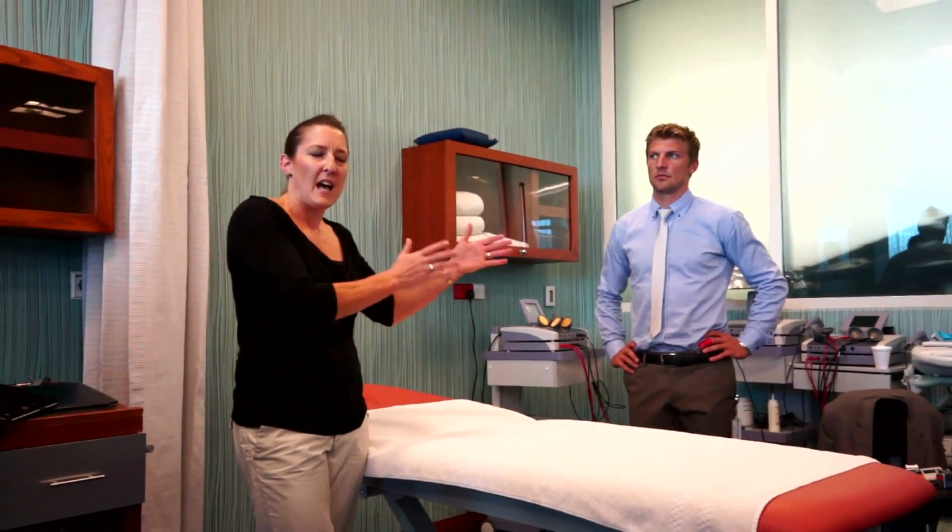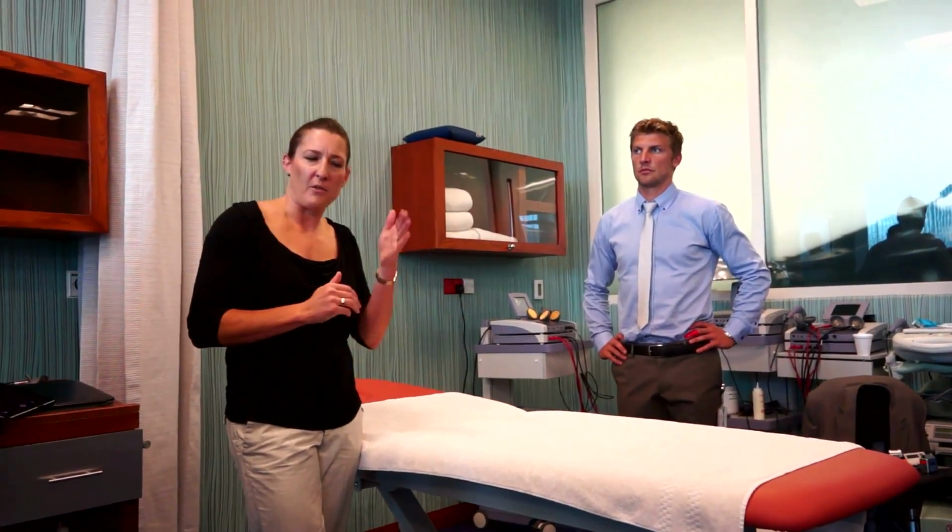So here we're going to present to you the methods of measurement that we used in the screening, and Andreas is also using these methods when he's looking at his management of the acute groin pain patients, and is able to use his measurements to assess the progress of the patient, because we have established some valid and reliable tests that we can repeat confidently, that we're testing the same thing each time, and therefore we know the error measurements, and therefore we can see whether the patient is improving over time.